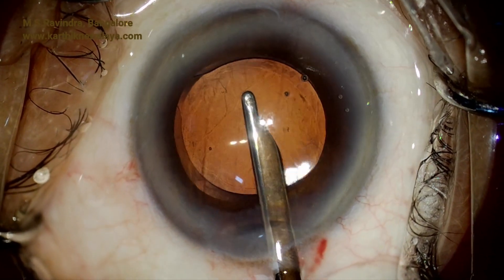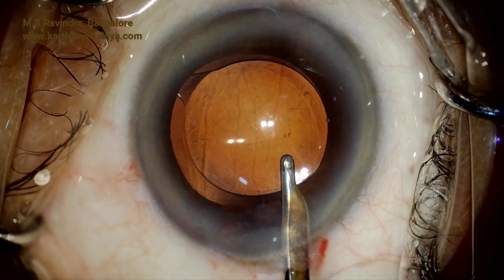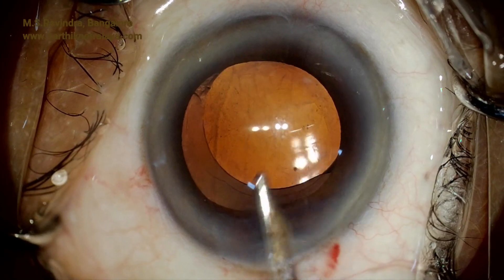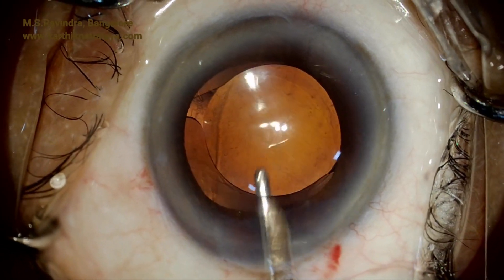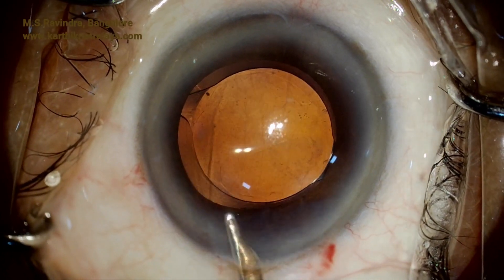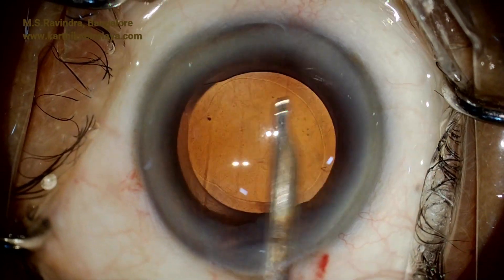Because it is a dispersive viscoelastic, additional time is needed to go to every nook and corner of the anterior chamber and the angle region, especially to minimize the postoperative pressure hike. The visco behind the lens is then removed. There is no need to hydrate the stroma of the tunnel — the tunnel automatically closes at the end of surgery, producing about half a diopter of surgically induced astigmatism (SIA). Thank you.